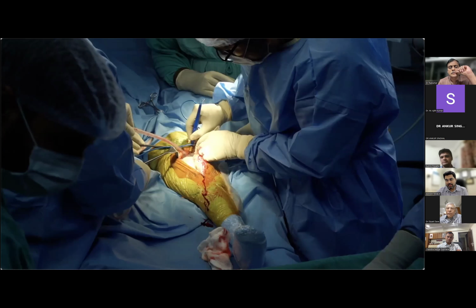So 1 pack cement for the femur, 2 pack for the tibia. Okay, exactly why that reason? Can you just explain for youngsters? No, because we have a mold there. That mold takes that much of cement.